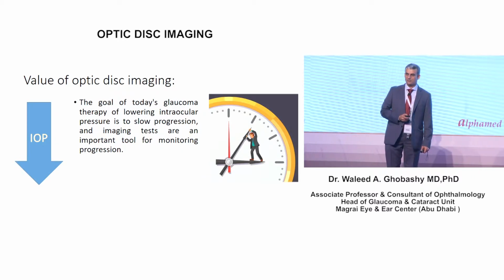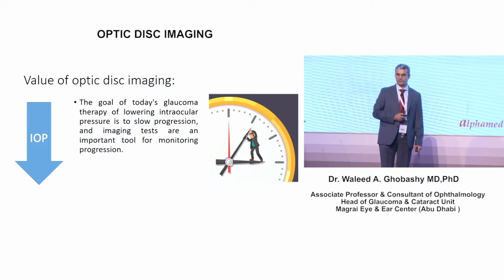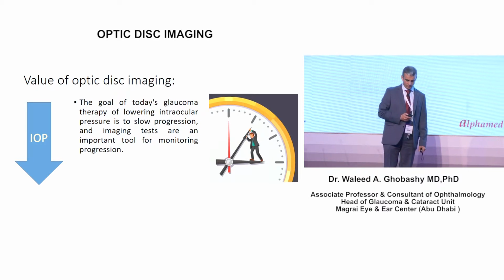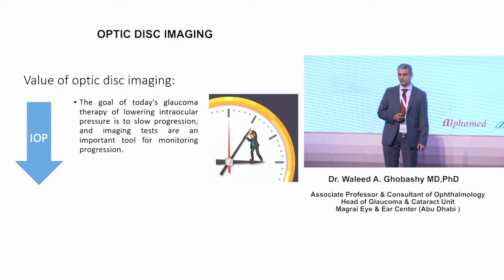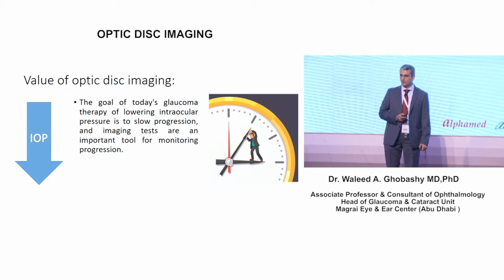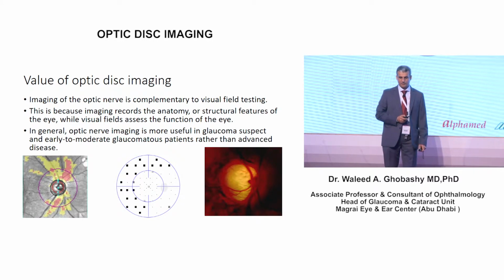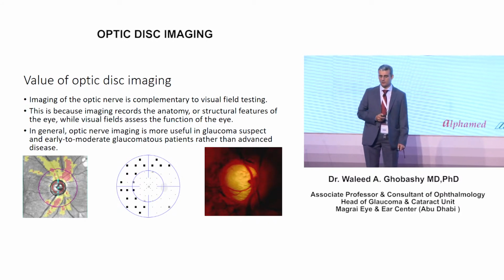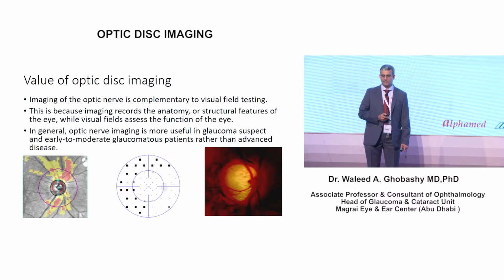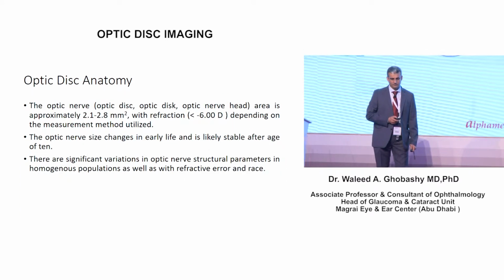From the beginning, the value of optic disc imaging comes from what we target in the treatment of glaucoma. We usually aim for lowering the intraocular pressure in order to slow the progression of glaucoma, and imaging is our tool to monitor that progression. Imaging of the optic disc is complementary to visual field testing, as imaging is usually about the structural changes of the glaucomatous eye, while the visual field is more concerned with the function of the optic nerve.